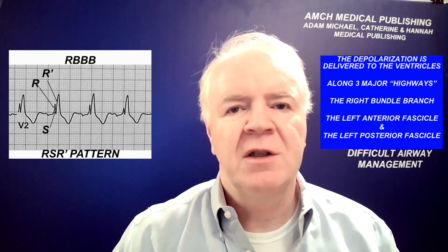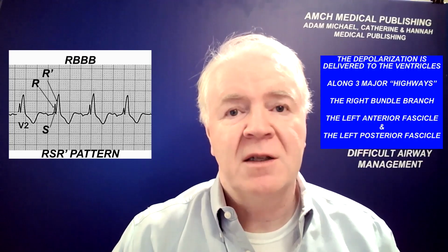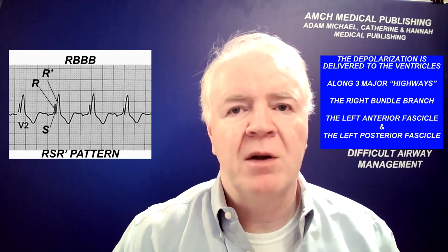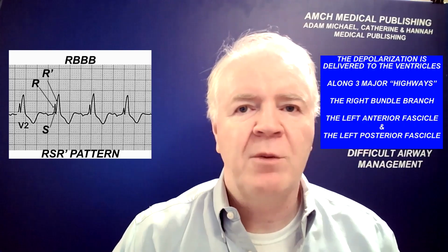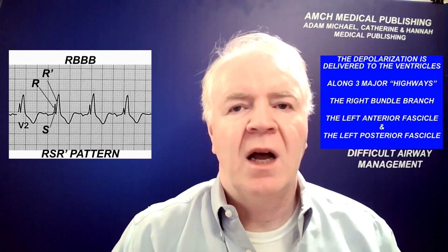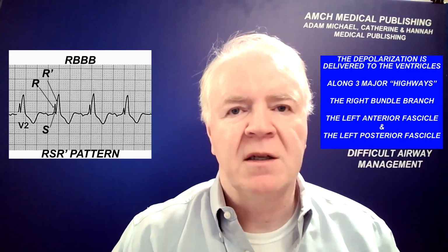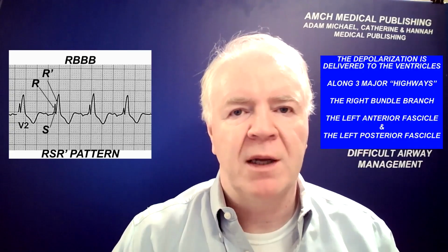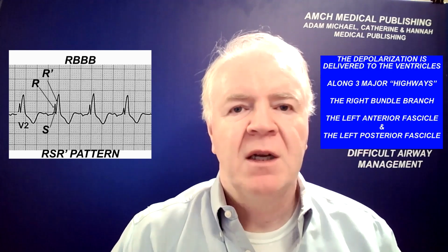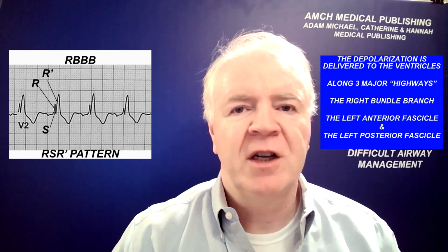Finally, the right ventricle depolarizes, and it's the last to do so, and it depolarizes towards V1 and V2, and there's another positive wave. It's not just an R wave, we call it the R' wave, moving towards V1 and V2. This overall RSR pattern is sometimes referred to as the M complex, and a reciprocal shape, that is an inverted M, is seen over the left ventricular leads.